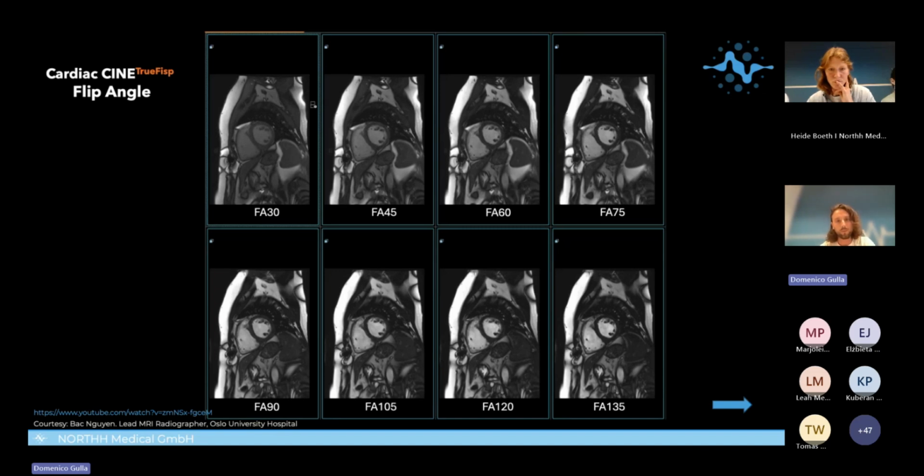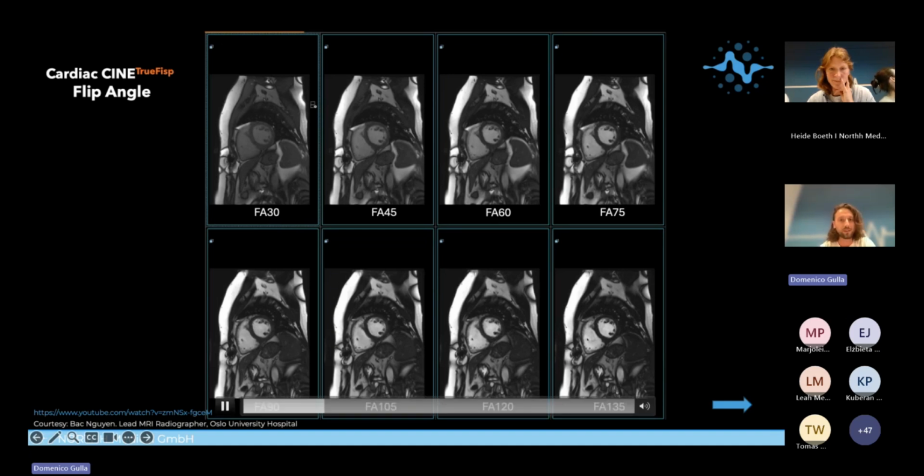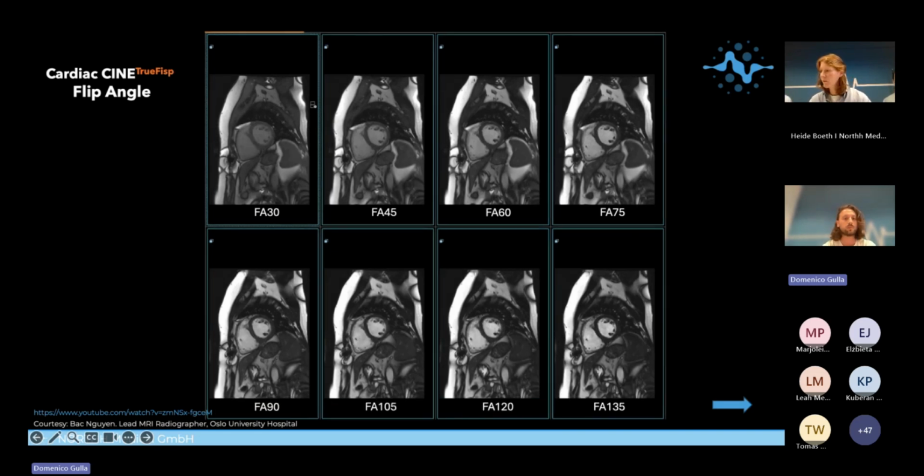So in fetal cardiac MRI, we can also do that, but with a slightly different acquisition. Here, for example, it's a case at 1.5 Tesla, at a gestational week of 27. And in this case, I was really lucky because there was not so much liquid. The baby was. Can you see that, Domenico? Just as information, it will probably come up quickly.